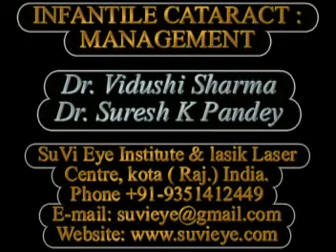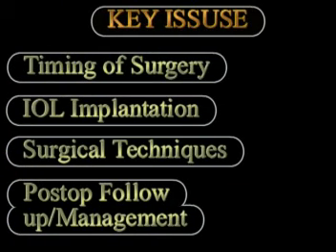Hi, I'm Dr. Vidushi from SuVi Eye Hospital, Kota, Rajasthan, India, and in this video we discuss the management of infantile cataracts. The key issues in these cases are the timing of surgery, which IOL to implant and whether or not to implant the IOL, the surgical techniques, and most important, the post-op follow-up.